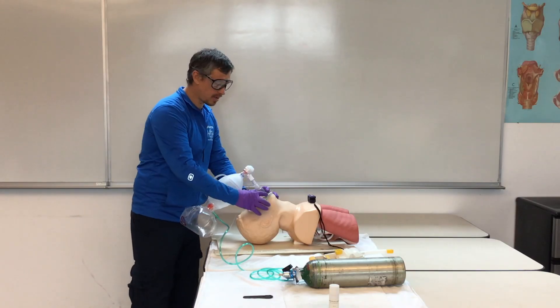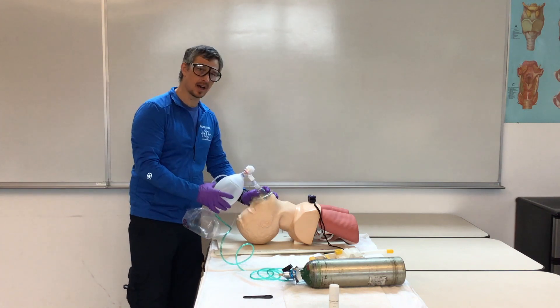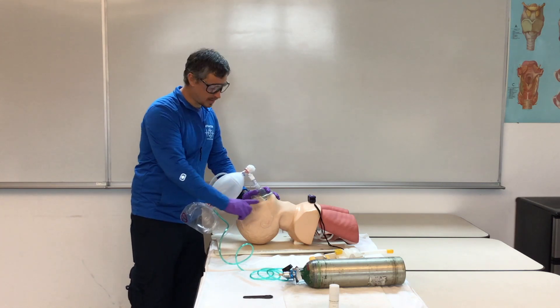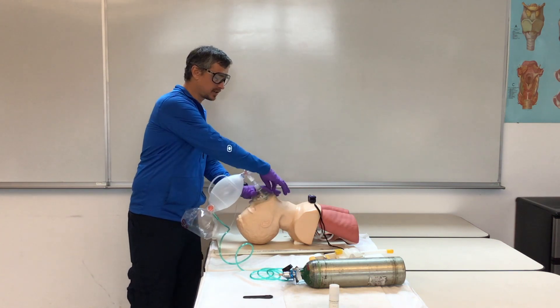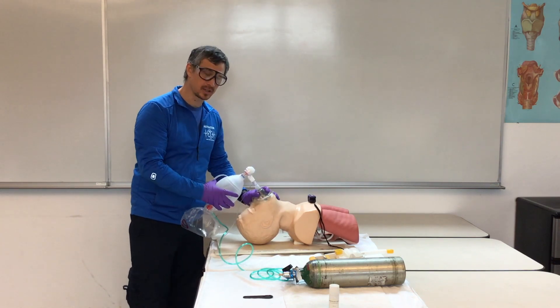The C-E grip on the mask and the face seal is one of the most difficult pieces of ventilating a patient. Air can escape through the corners of the mouth or through the nose. If you have a patient with facial hair, it makes it even more difficult. So take that extra second whenever you apply the mask to make sure you have a good seal.